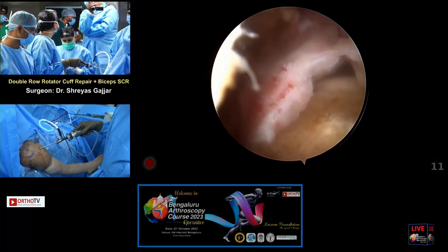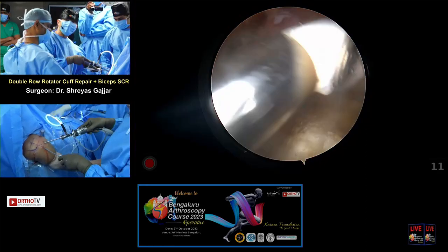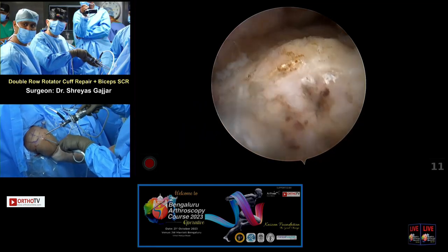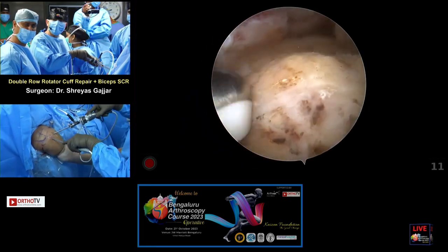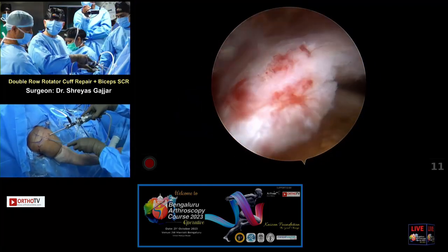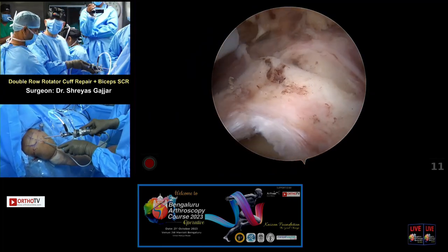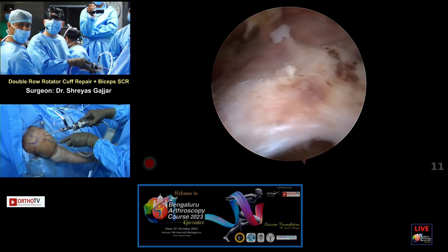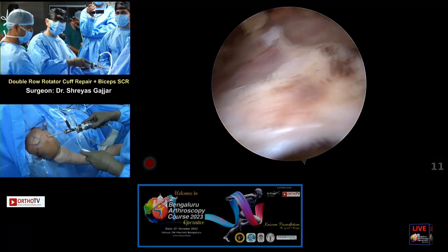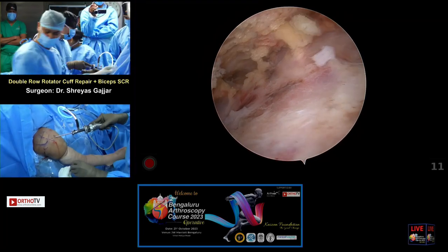Can I have the RF, please? So I'm just preparing the tuberosity laterally for my double row. Shaver, there. Sister, load it on the golden handle, please. I'll tell you when I need it.